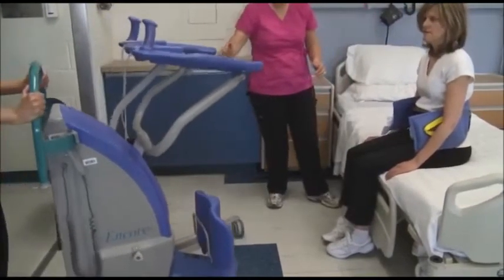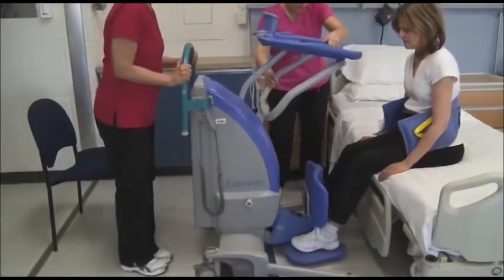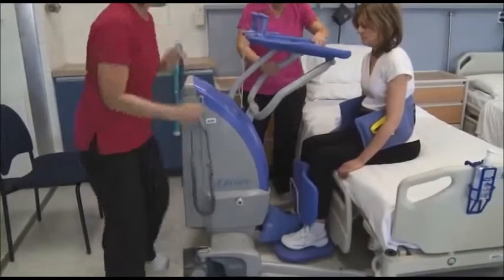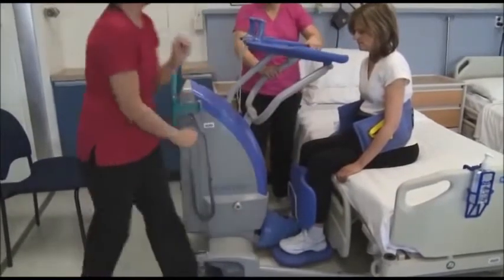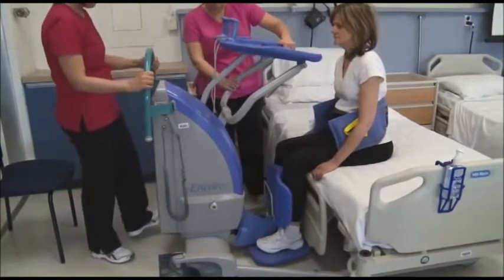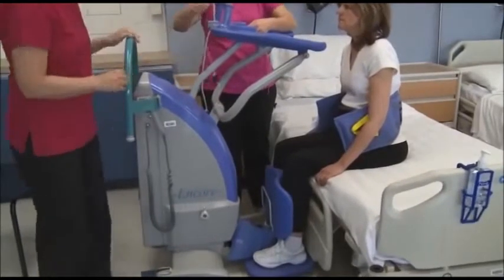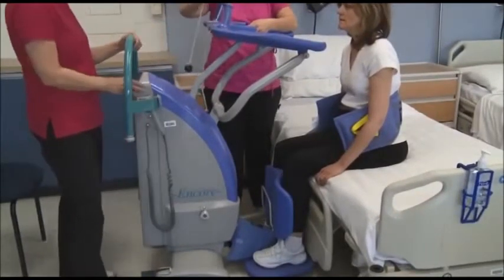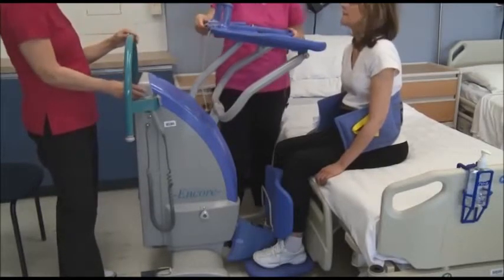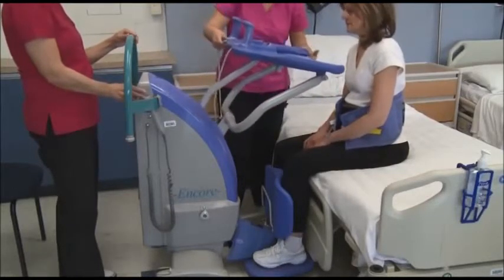And Tracy is going to ensure, because I can't see, that the client is able to lift their feet onto the support and go close to the leg but not tight, so that room can be sitting there. Okay? Now, the brakes must be on because we've positioned our client. And the other thing I'm going to do is lower the railing, and because I can't see, Tracy's going to make sure that the railing is within reach for Carmen.